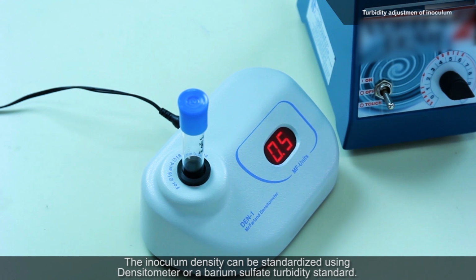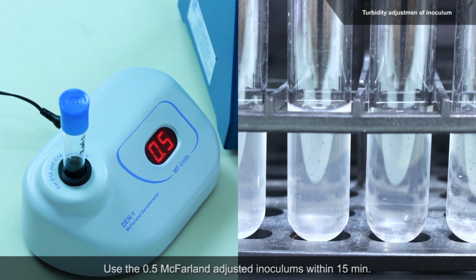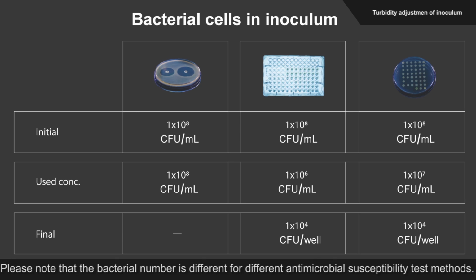The inoculum density can be standardized using a densitometer or a barium sulfate turbidity standard. Use the 0.5 McFarland adjusted inoculums within 15 minutes. Growth method inoculum may also be prepared. Please note that the bacterial number is different for different antimicrobial susceptibility test methods.